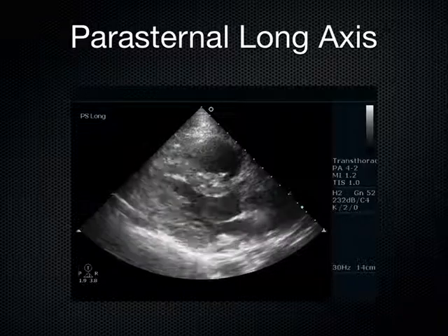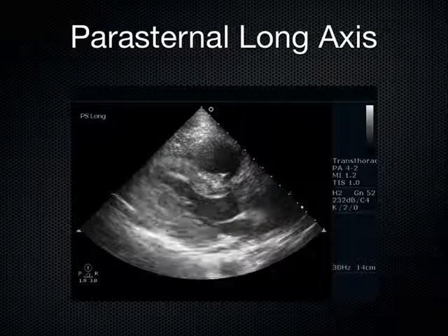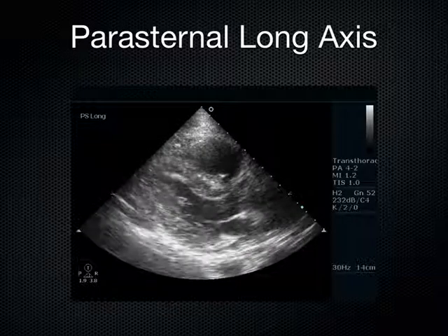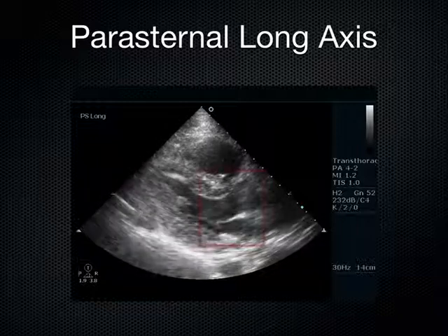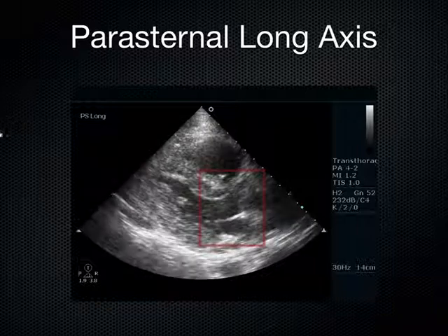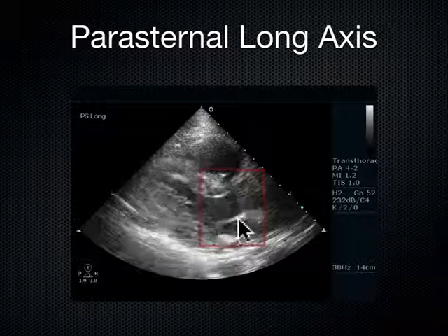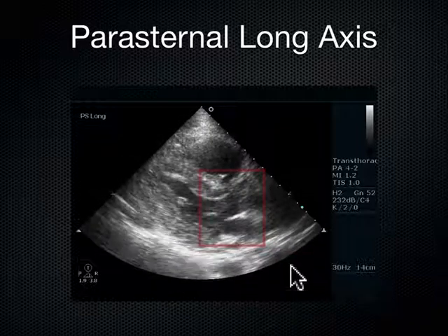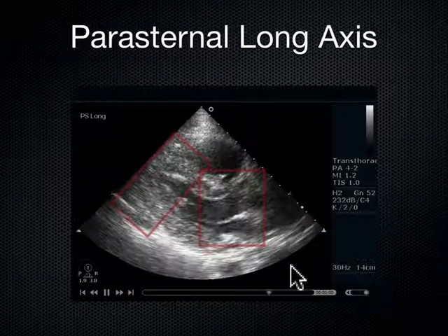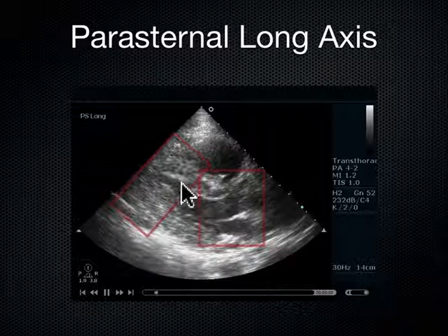What do you think about this heart right here? First question that comes to my mind, I look at this heart, I look down at the patient, and I'm like, are they dead? Does this patient have a pulse? Because this heart is really not looking good, right? So first of all, we've got that mitral valve. The mitral valve is just sort of camping out right here, not doing hardly anything at all. It's almost just kind of fluttering along there, not really making any decent headway towards the septum. Then we look at the chamber size of the left ventricle here, and we see that interventricular septum.